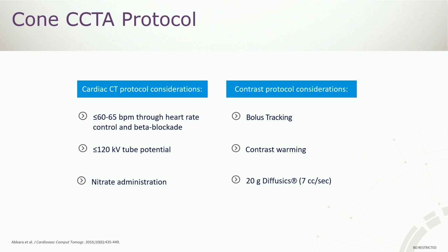And then we do nitrate administration sublingually. Our nurses take care of that for us before we even start the exam. And then we use bolus tracking. You can also utilize bolus timing, but we wanted to keep things uniform across our system. So for all of our other angiography work in CT, we utilize bolus tracking. We just wanted to stick with that to keep things simple for the techs.